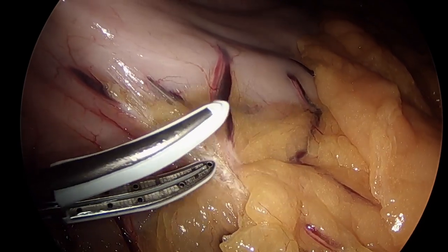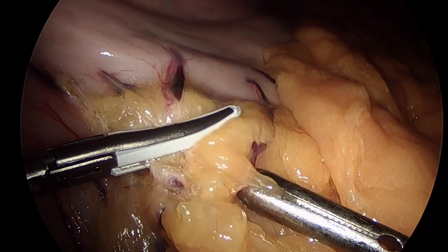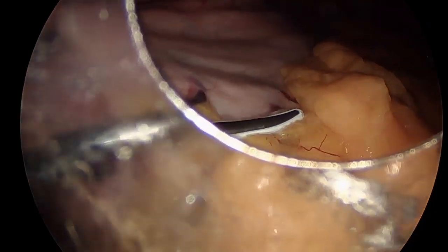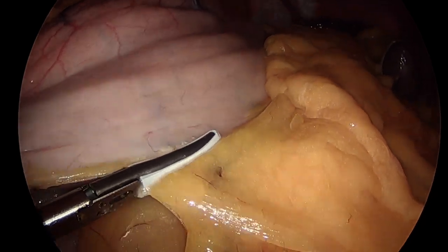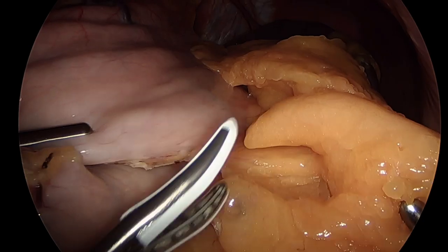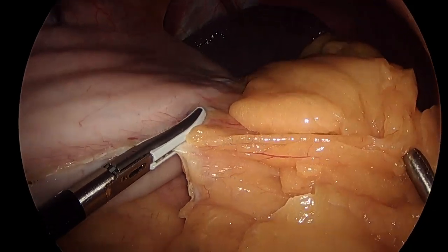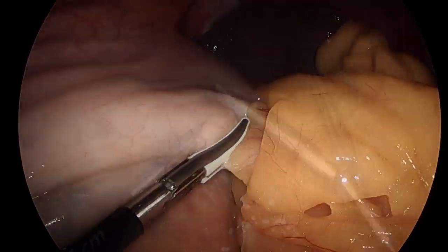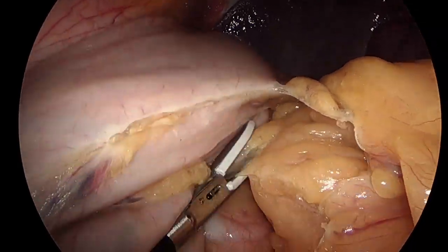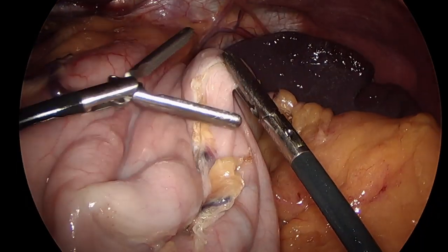We perform the remainder of the operation with an insufflation pressure of 8 mmHg. We begin the dissection along the inferior aspect of the stomach greater curvature, around the junction between the body and the antrum of the stomach, where the gastroepiploic tissue is relatively thin and easier to enter into the lesser sac space. A grasper is used to hold the stomach on tension near our plane of dissection, while the assistant retracts the greater curvature fat and vessels. Using a bipolar sealing energy device, we dissect close along the edge of the stomach up towards the fundus, dividing the gastroepiploic vessels. It is important not to divide far lateral from the gastric edge in order to preserve the gastroepiploic blood supply to both the omentum and the spleen.